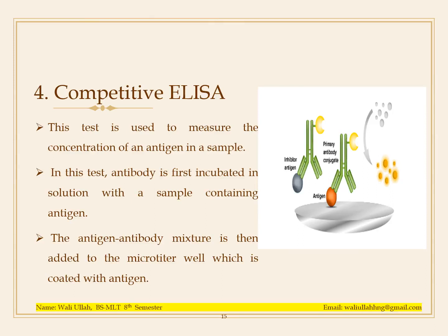Competitive ELISA. This test is used to measure the concentration of antigen in a sample. In this test, antibody is first incubated in a solution with a sample containing antigen. The antigen-antibody mixture is then added to the microtiter well, which is coated with antigen.